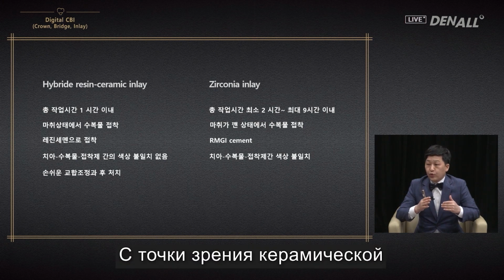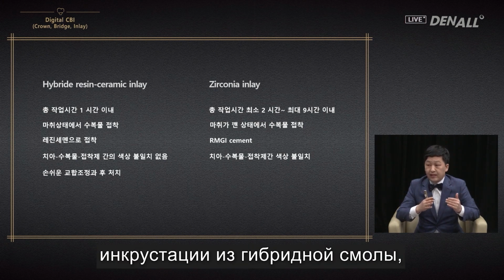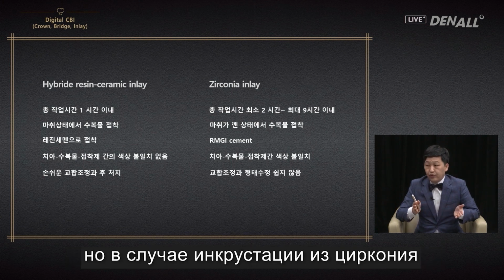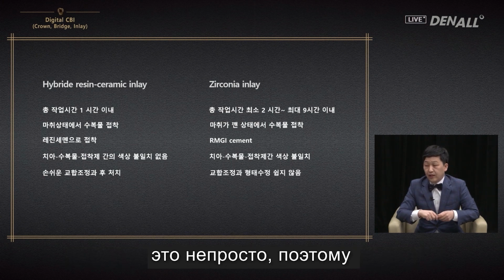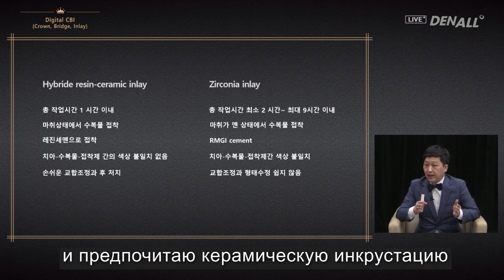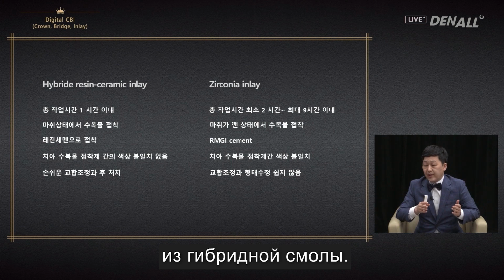In terms of a hybrid resin ceramic inlay, you can adjust the occlusion and the shape after treatment easily, but in the case of a zirconia inlay, this is not easy. That's why I don't do zirconia inlays and I prefer hybrid resin ceramic inlays.